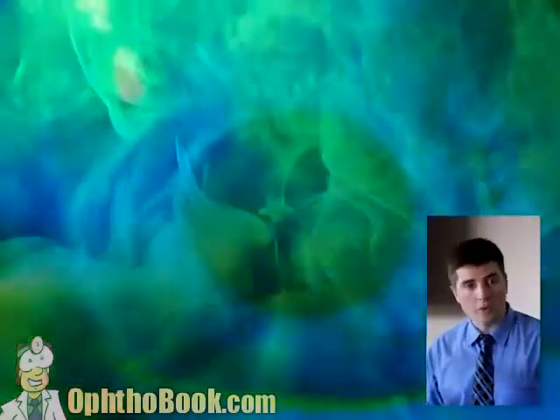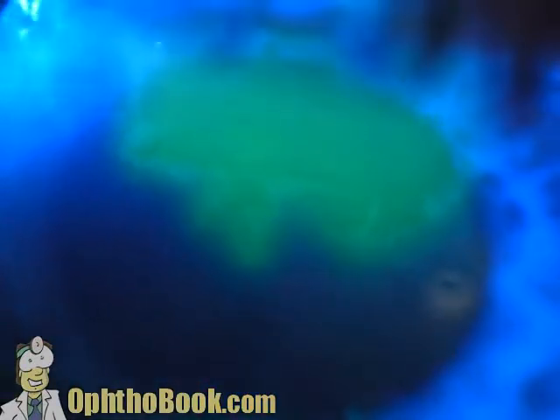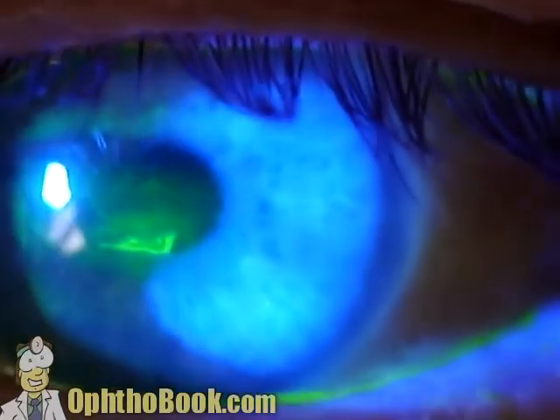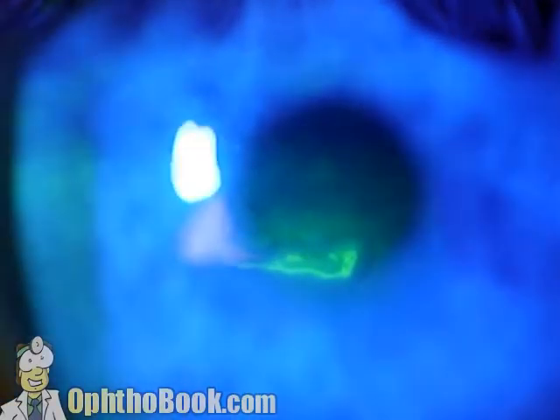at things like a corneal abrasion, which may be hard to see with the naked eye, even using a microscope, but raw areas will uptake this yellow material and it'll glow under a blue light. I'll give you a better example here. Scratch on the surface of the eye, and that fluorescein sticks to that area and is very easy to see with the blue filter. It's also useful for finding leaks.